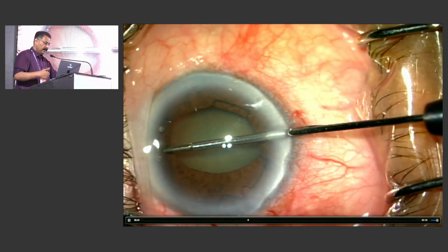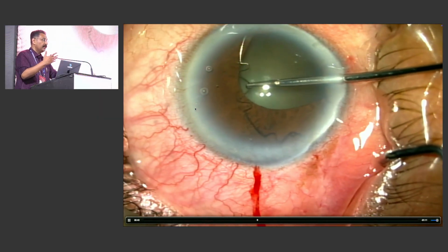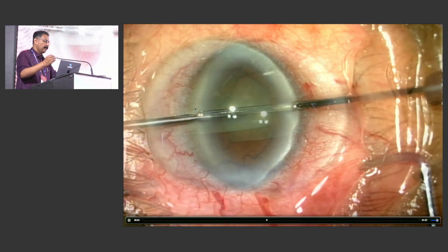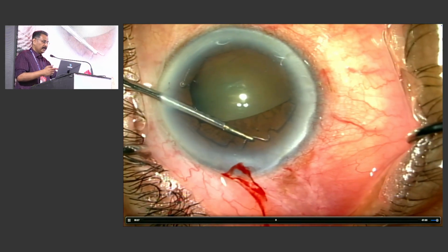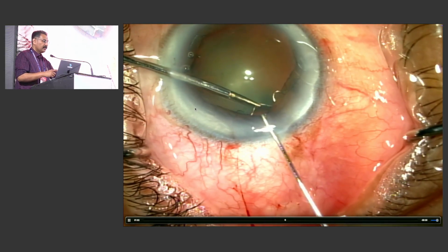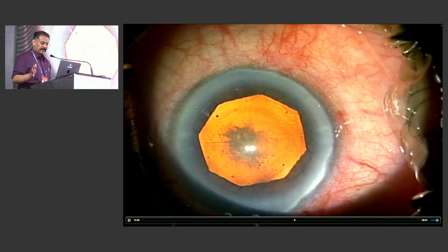And after that, using a paracentesis, see, sometimes when a large arcus is there, the iris may disappear into the periphery and you may not see it. So you can use 2 hands, just retract a little bit and bring it into the area where you can see, and then hold on to that. And then again the last one, holding, pulling and pushing. This way you can easily engage it and it becomes so widely dilated and nothing happens.